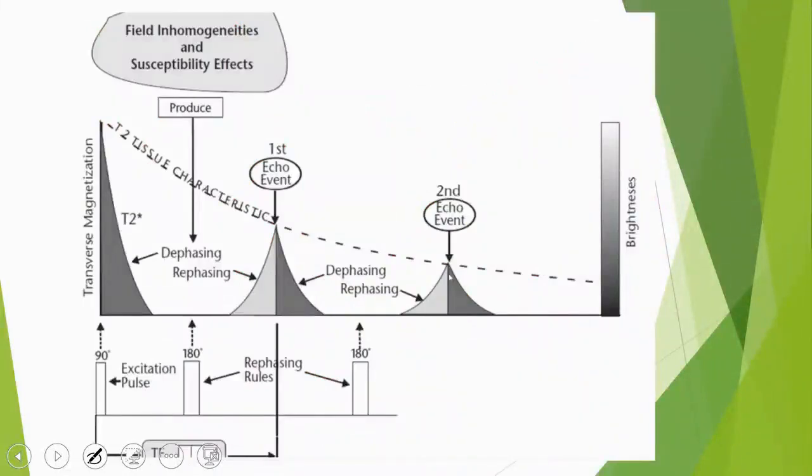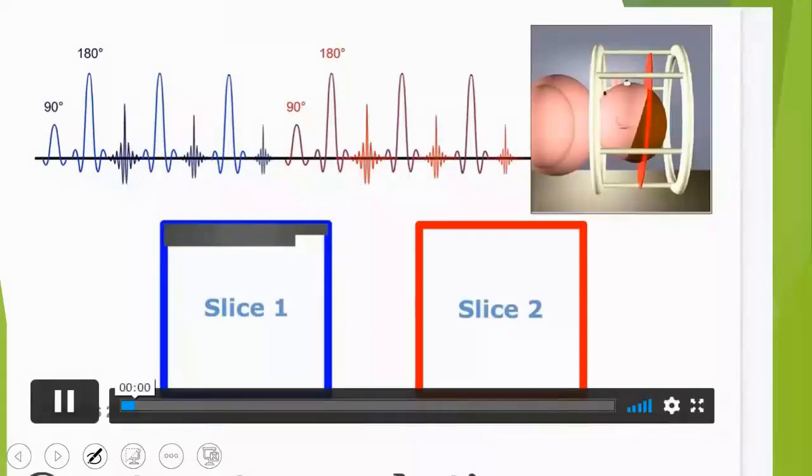During this period, there is dephasing, and when you apply 180 degrees, rephasing occurs, followed by dephasing again, leading to a decrease. However, the signal amplitude here is high, and the amplitude decreases over time. So, if you increase your echo train length beyond the number of multiple 180-degree pulses, it will reduce the intensity of the signal.